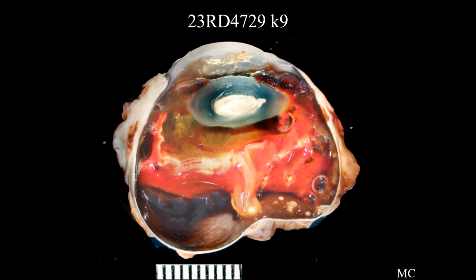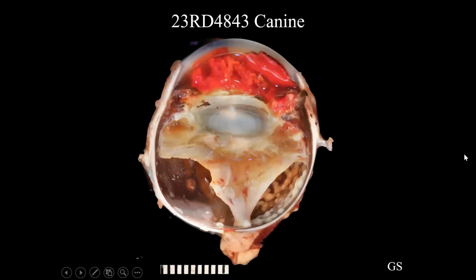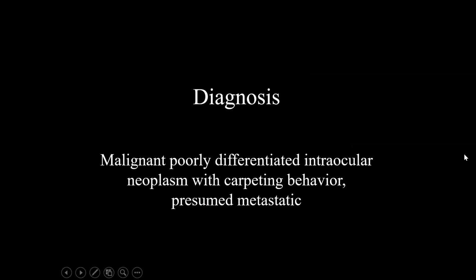It's probably not going to be too significant to our discussion, but the dog is also leptospirosis positive and has been on prednisone and doxycycline. Maybe somewhat significant. So here's our gross presentation. And we have these little raised tan white foci lining the inner choroid and kind of on the outer retina as well, which is maybe somewhat reminiscent, although not as visually impressive as, this case back here, if you recall.